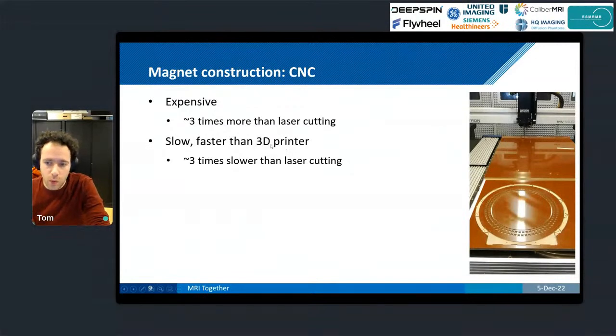So this is, again, where the investment into the materials actually pays off in the end. The accuracy is very good. It's higher than we need to. So this is something just to find your optimal in terms of cost and performance.